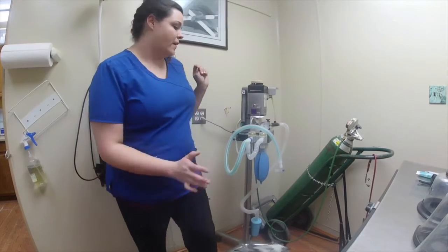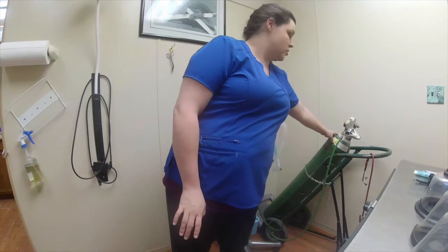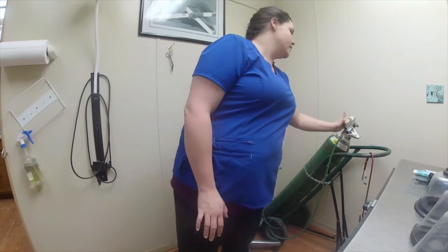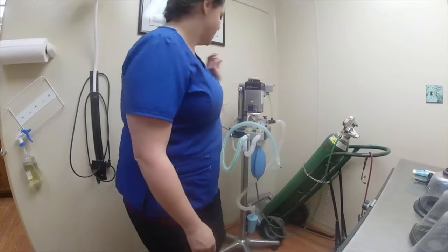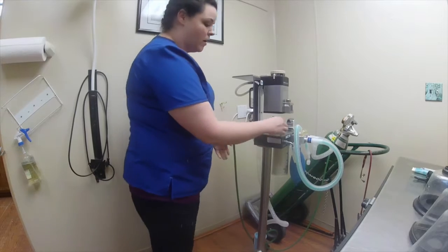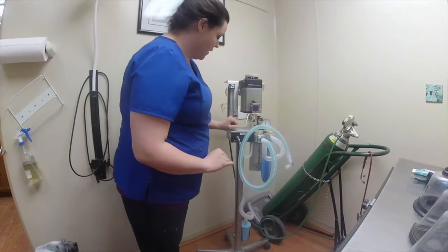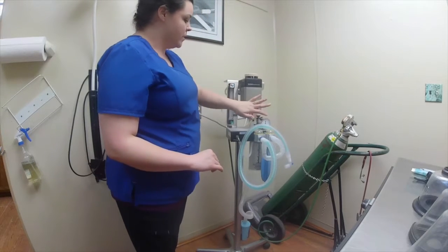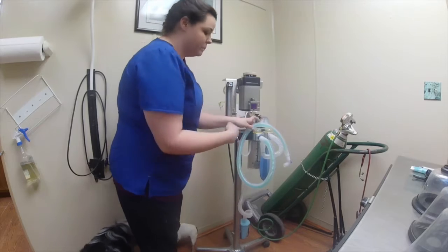We are going to talk about our anesthesia machine. So over here is our oxygen tank. We have our tank pressure and our line pressure. The line connects all the way to here into the back of the machine, into our flow meter here. We have our flow meter, our flush valve. This is our vaporizer, our soda lime container.